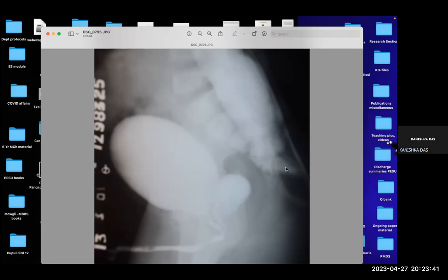So what is your differential diagnosis? What structure do you think this is? A diverticulum. What type of diverticulum? It originates from the prostatic urethra, or the lower prostatic urethra, goes up and is related to the back of the bladder. Ejaculatory ducts? Anything related to the mesonephric or paramesonephric duct will be there, because they open there. If from the vasal structures, it would be on two sides, or in the midline. What else opens in the midline? The prostatic utricle. So it can be a remnant of that.